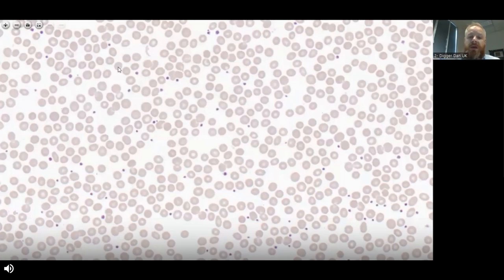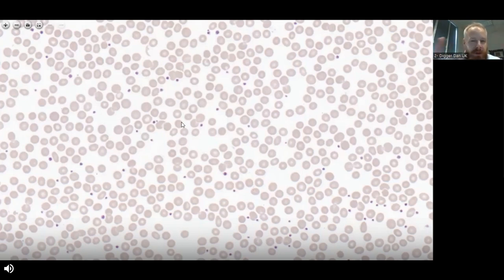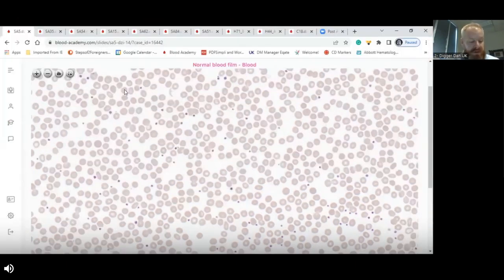With our technology today we can get very accurate platelet counts across the spectrum of platelet numbers. But we do have to be aware that sometimes, because of abnormalities in platelet appearance, the analyzers might produce falsely reduced platelet counts. As a rough rule of thumb, if we are looking at a blood film under 100× oil immersion in the correct part — where red cells are slightly touching or overlapping in the monolayer — we should see approximately 7 to 20–25 platelets per field on average.